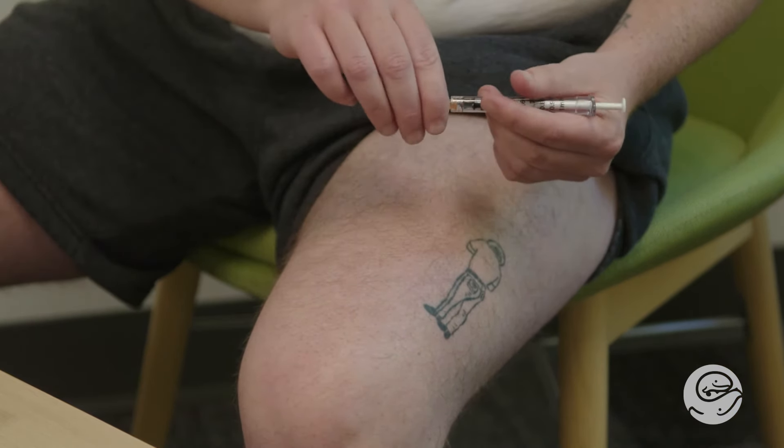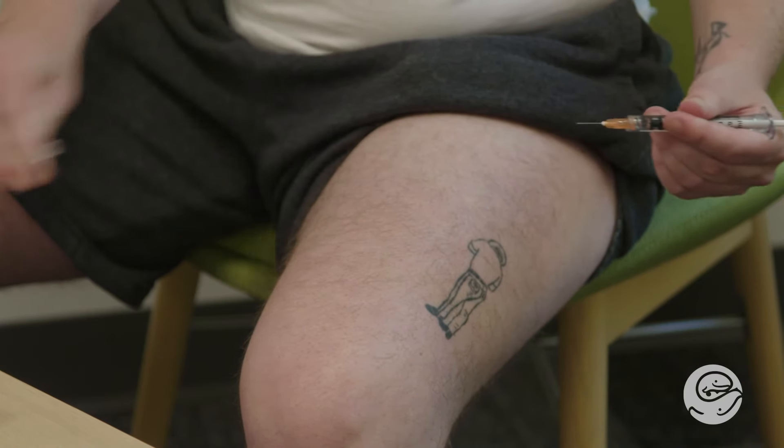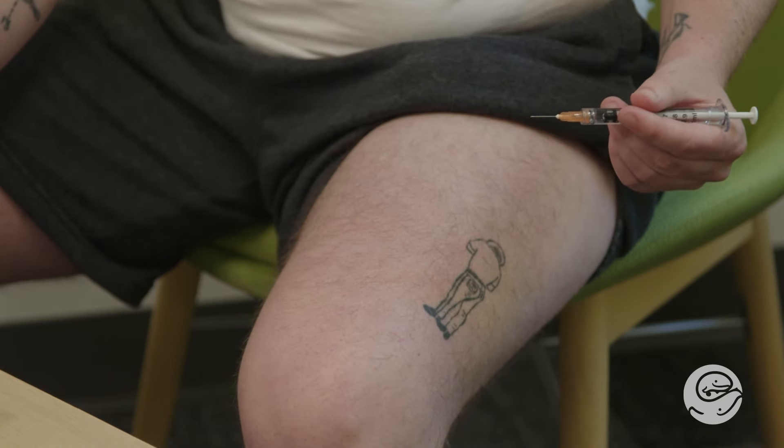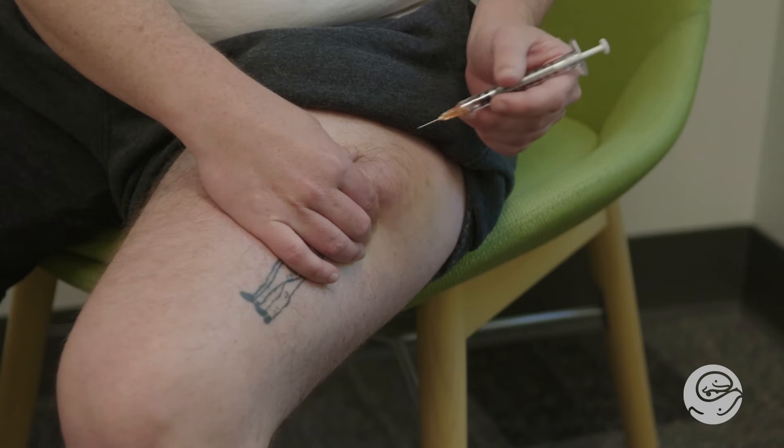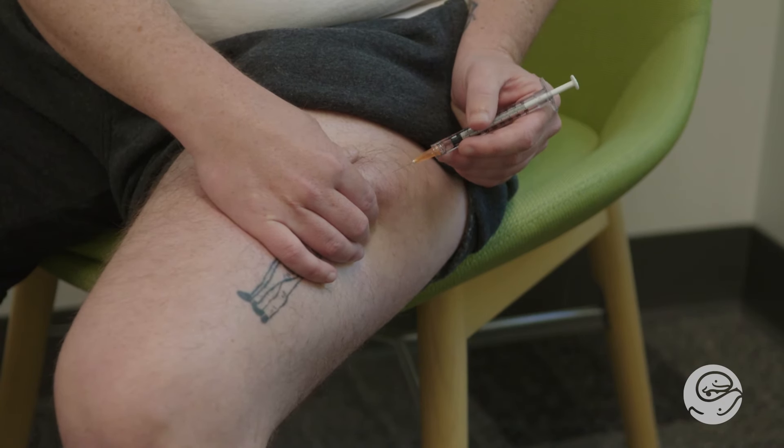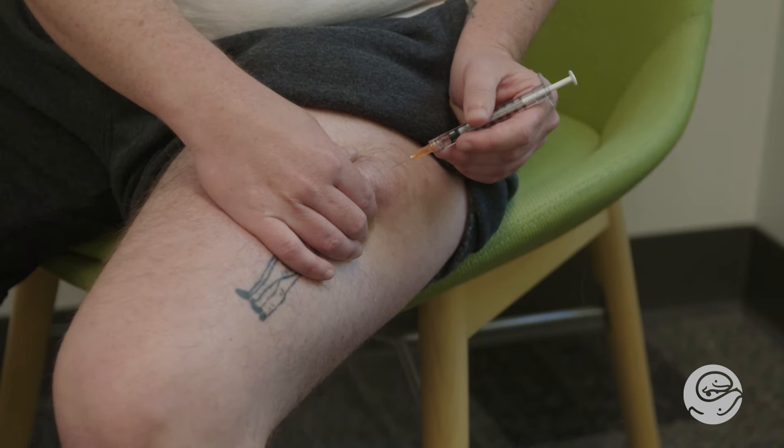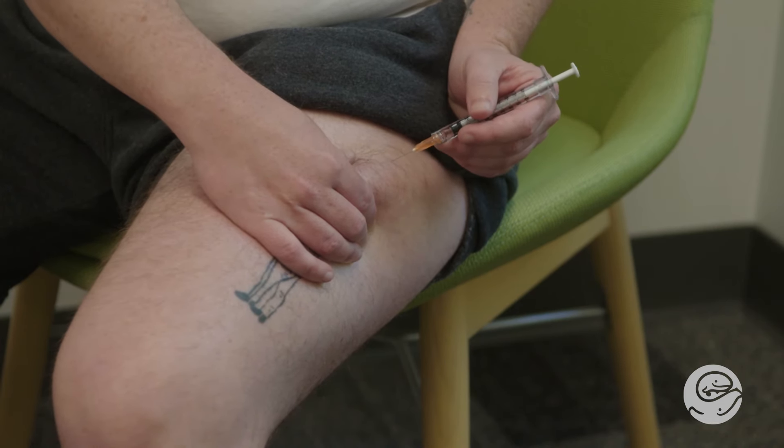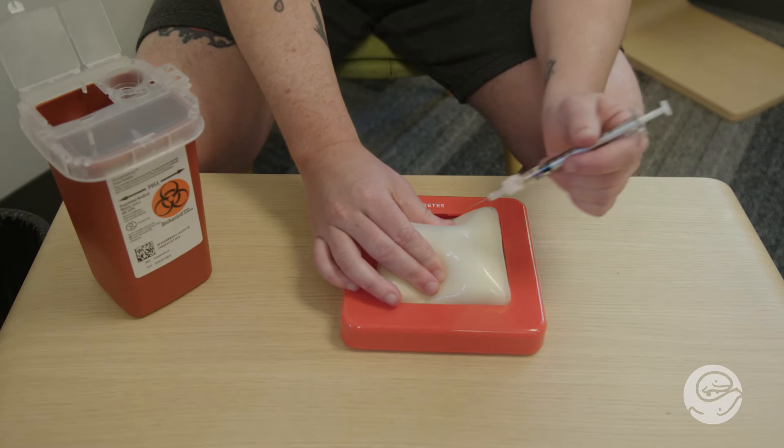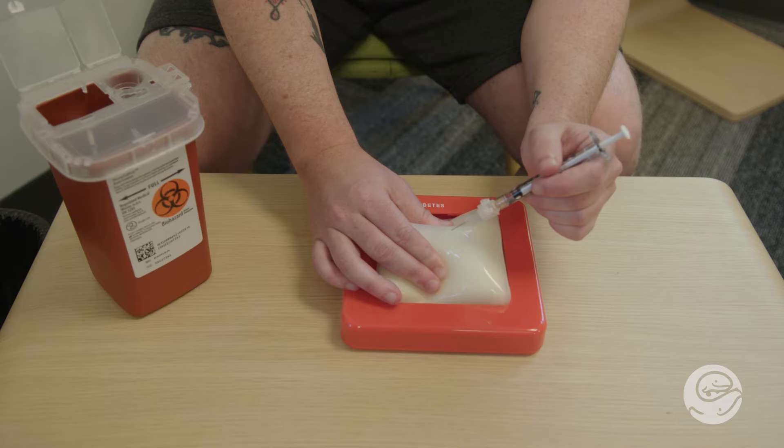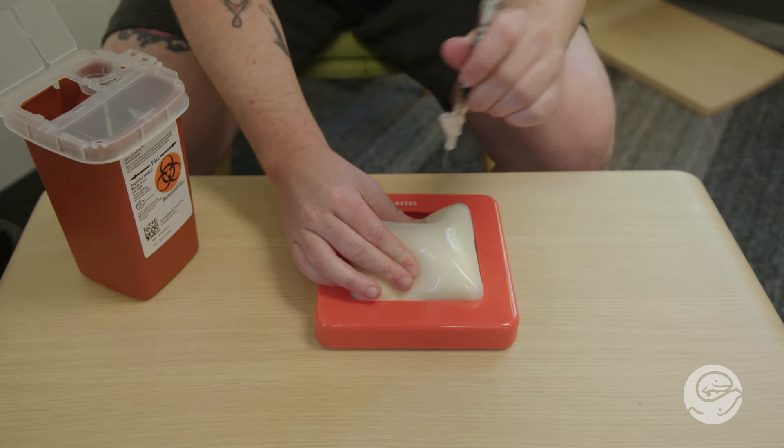Hold the syringe like a pencil. Keep your fingers away from the needle and make sure that you have an easy way to put your finger on the plunger once you insert the needle. Depending on the recommendations from your care team, you will either insert the needle into the injection site at a 45 degree or a 90 degree angle. This is a 45 degree angle. This is a 90 degree angle.